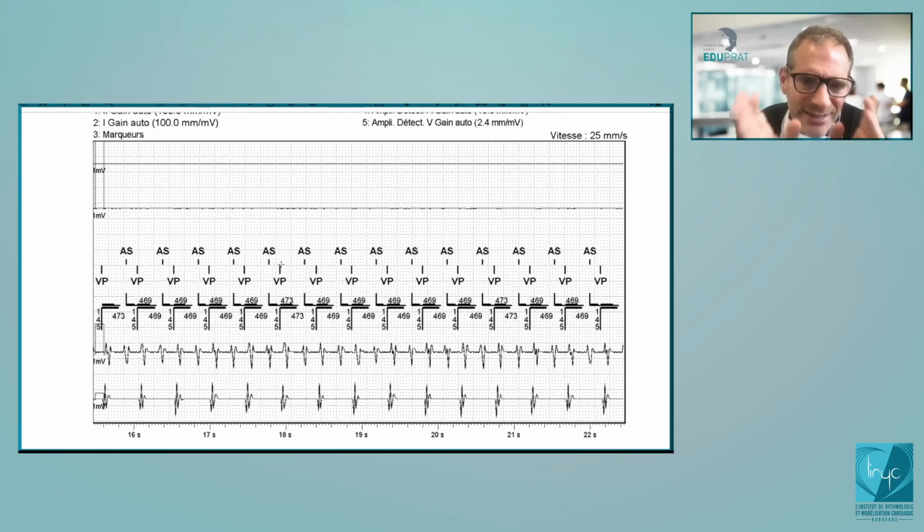When you program these parameters, the atrial blanking following ventricular pacing, the PVAB, if you're programming long, you will decrease the risk of what you have seen just before, the problem of oversensing of the far-field R signals. But be careful, if you program long, you may have this kind of problem in some patients. The longer this blanking, the more the risk of 2-to-1 blanked flutter.